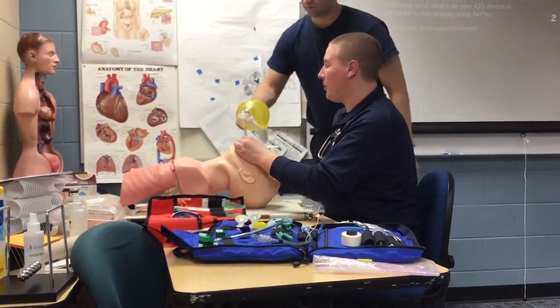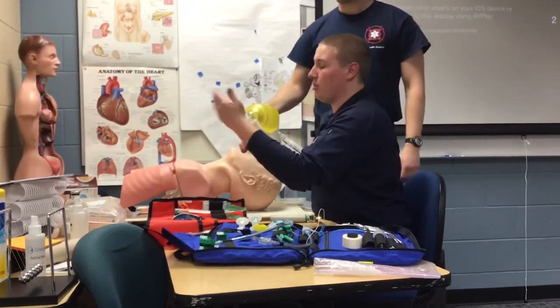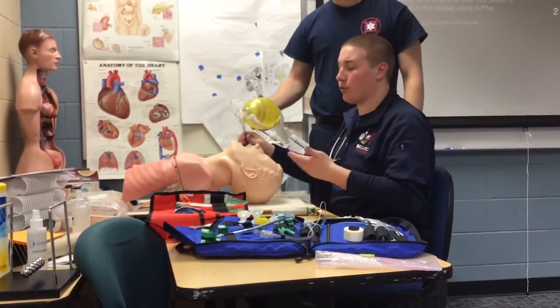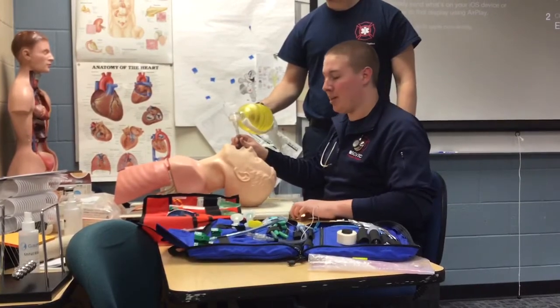have your partner attach the BVM, have him breathe air. We would listen to epigastric sounds, and then you'd listen for lung sounds. You'd also have the patient attached to SpO2 and end tidal as other ways of confirming. I also verbalized that I saw the chords before I passed the tube, another confirmation that I'm in.